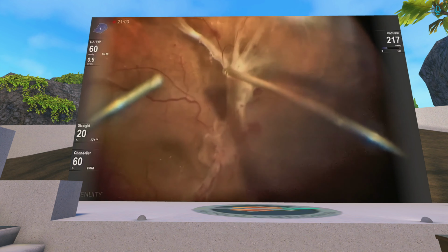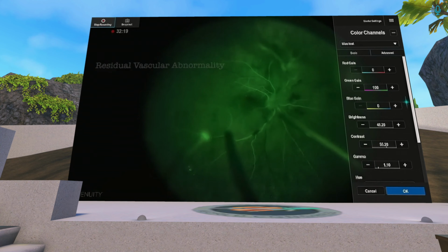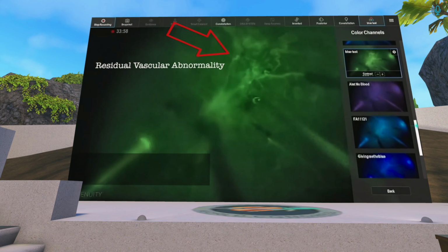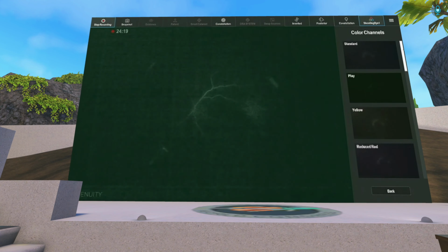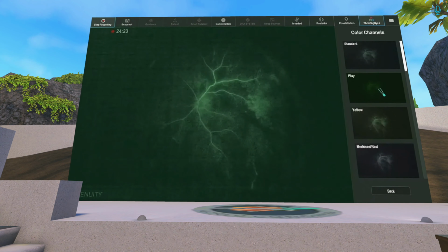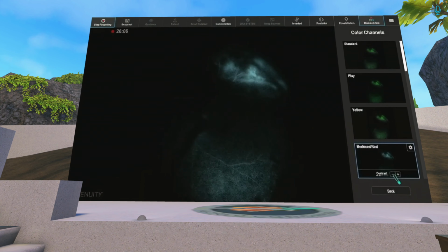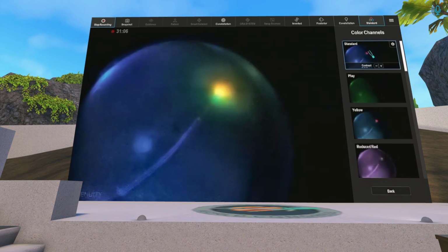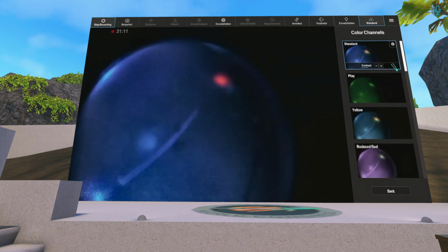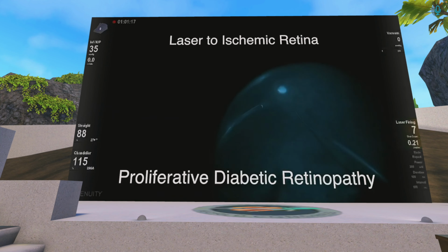But if you see these areas, as you're peeling under fluorescein, as Lukan was mentioning, if the vessels have any perfusion, the abnormal vessels are white against a dark background. So you've got a really high contrast situation, and you can really see the extent of the vessels and where exactly they're coming out of the retina. And you can get a nice atraumatic peel. We'll get to that in just a second. I can go over that again, and then we can stop the video.